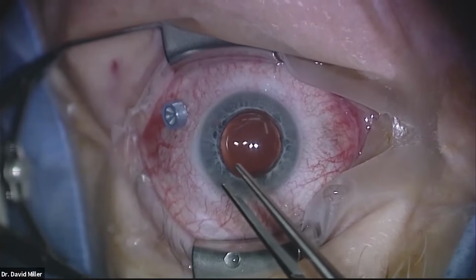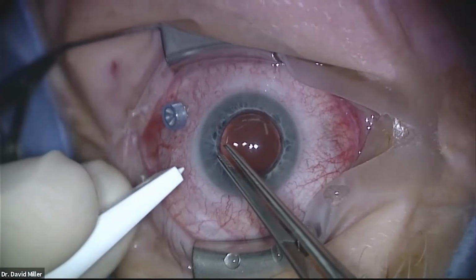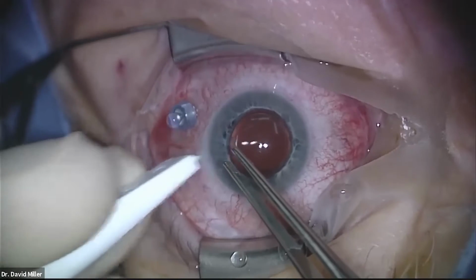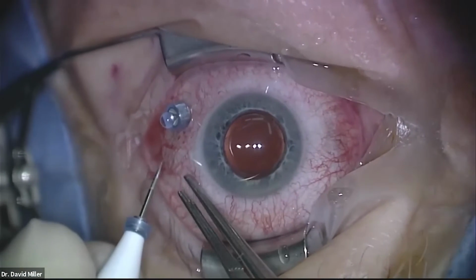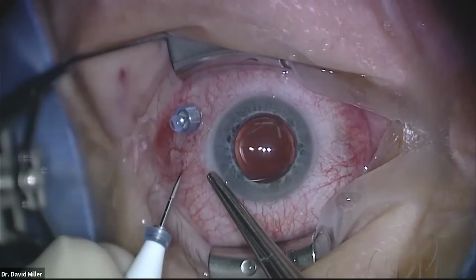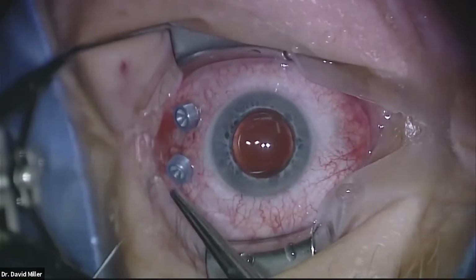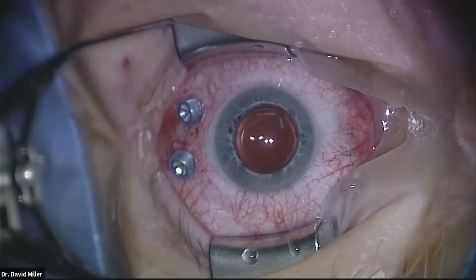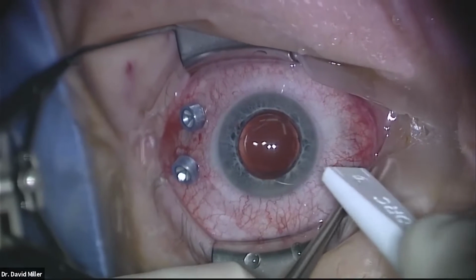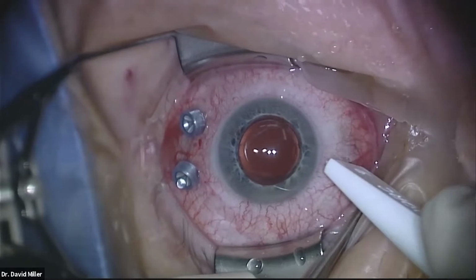This leaves the cannulas, rather, at an angle where they're almost facing me, as you can see. We also displace the conjunctiva a little bit. You can see how they're facing this way, not straight up. I put the working sclerotomies, like I mentioned, down between 3 and 2 o'clock and 9 and 10 o'clock.